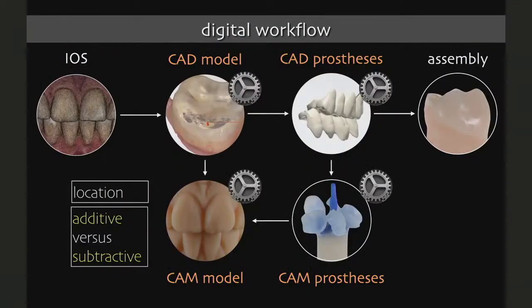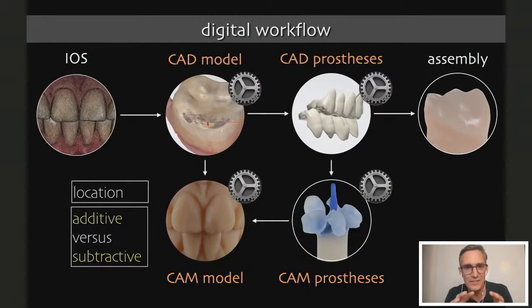So you need to have quite an understanding of these technologies, milling or printing. And the other thing is, where is it done? All this designing can be done by a dental technician, and can also be done by a dentist. Then we talk about the so-called chairside workflow. The manufacturing can be outsourced to a milling company, for example.